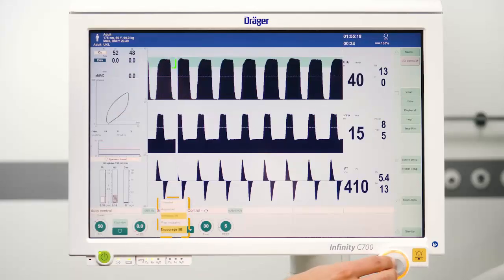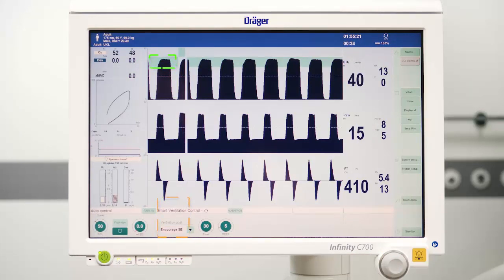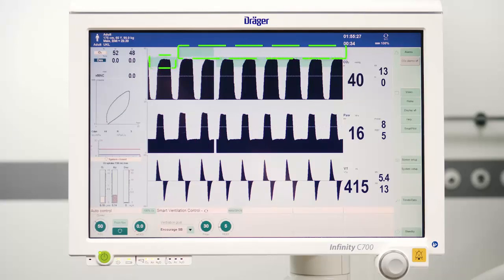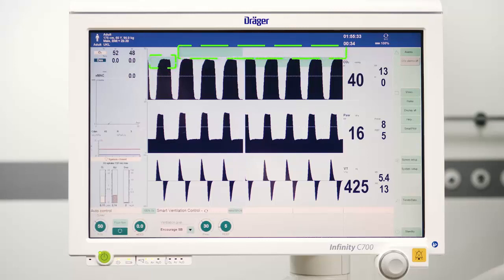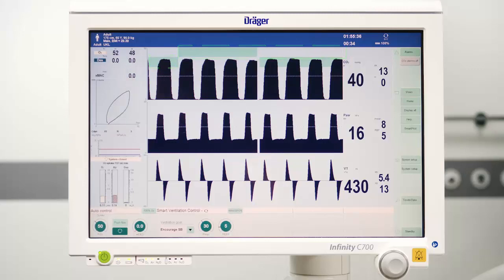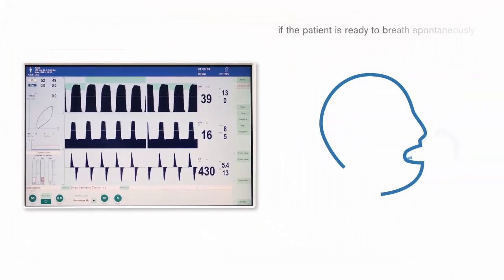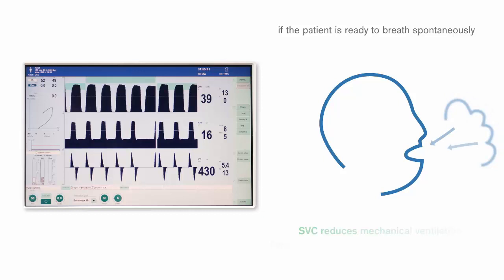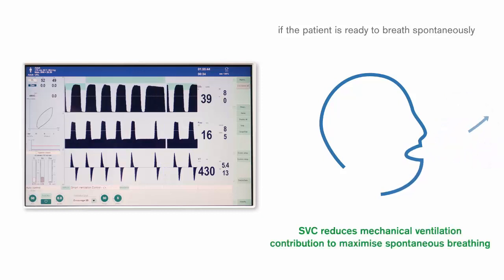Simply change the ventilation goal from controlled to encouraged spontaneous breathing. To stimulate spontaneous breathing, Smart Ventilation Control uses a higher target for end-tidal carbon dioxide, which can be seen on the green band on the screen. If the patient is ready to breathe on his own, Smart Ventilation Control reduces the mechanical ventilation to maximize the spontaneous breathing of the patient, allowing the patient to breathe spontaneously as early and as much as possible.